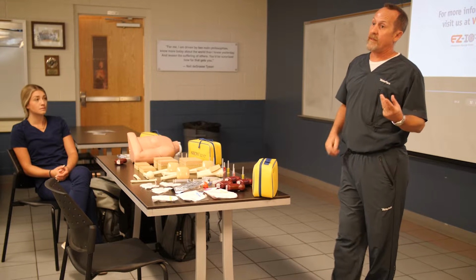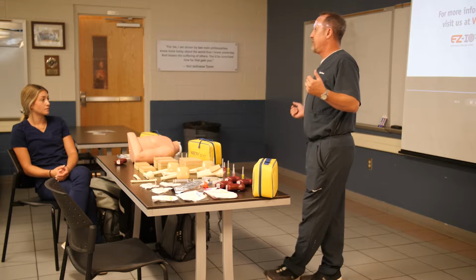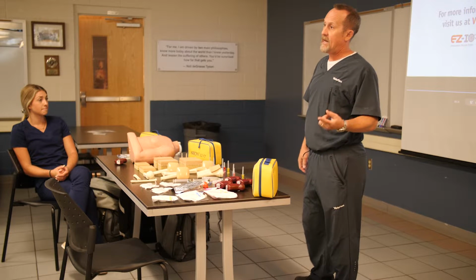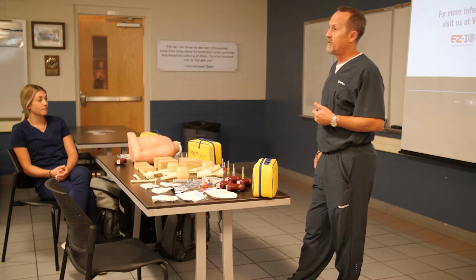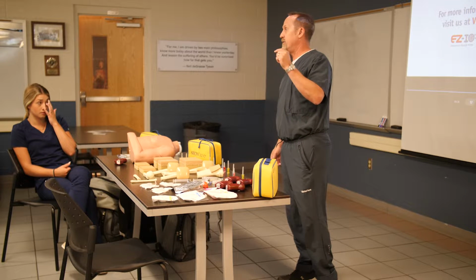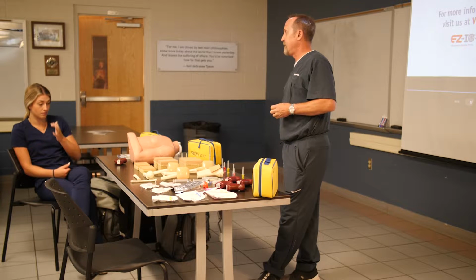The third reason why the proximal humerus is such a great spot is because for a very first time user of an IO, on their very first attempt going into the proximal humerus, you have a 97% success rate, okay? So think about that, you've never used an IO before, that's such a small window of failure, you guys are gonna hit the right spot pretty much every time, okay?